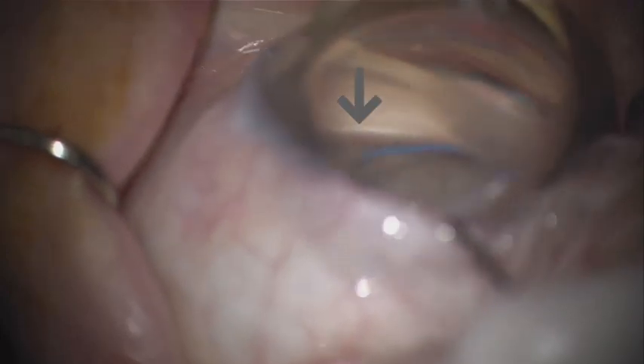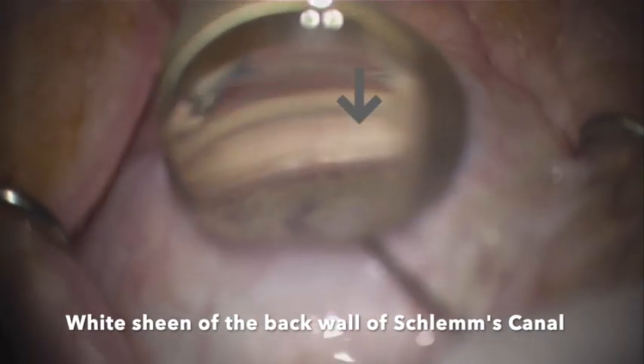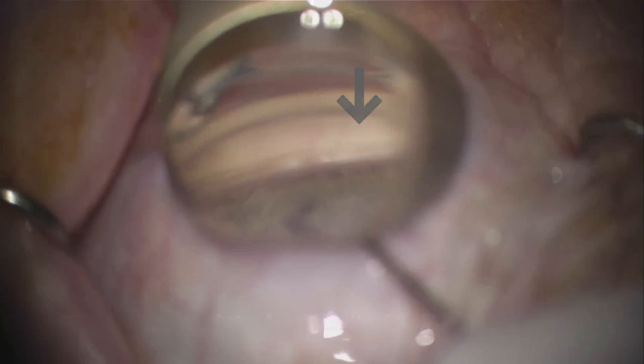Then, without actually fully removing the tip, we can dial the microcatheter back into the same Schlem's Canal space and then use the catheter by pulling in order to unroof the trabecular meshwork and expose that white outer wall of Schlem's Canal.